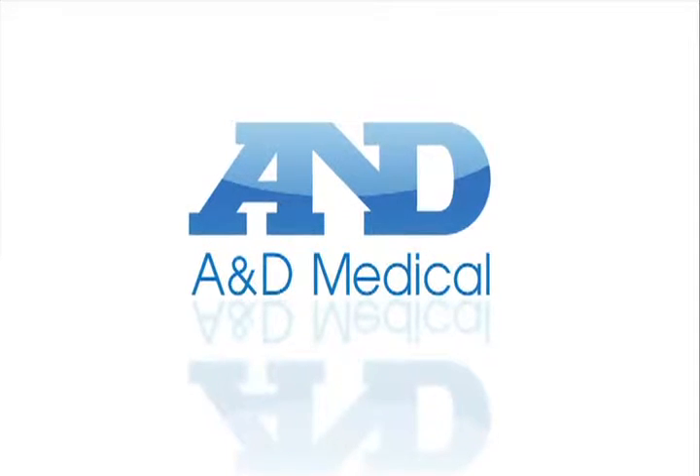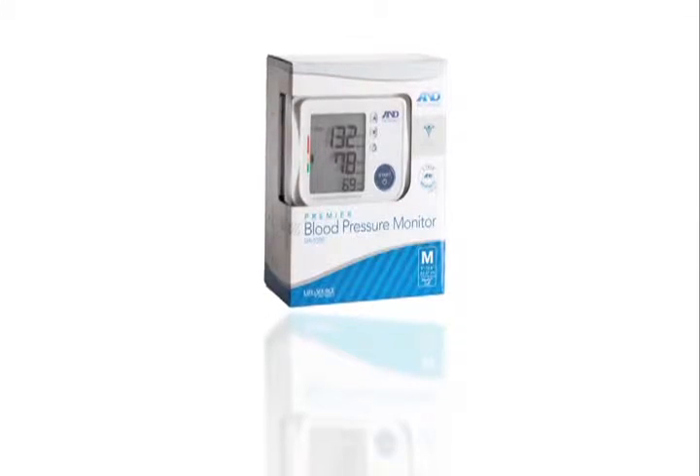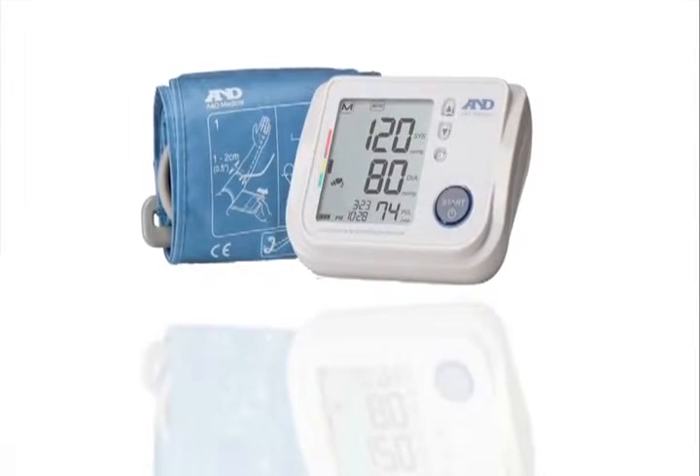Tracking your blood pressure is important to your well-being. The A&D Medical Premier Blood Pressure Monitor makes it easy to keep tabs on your health.